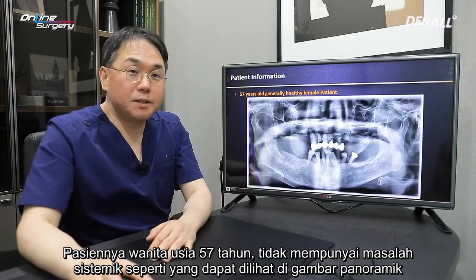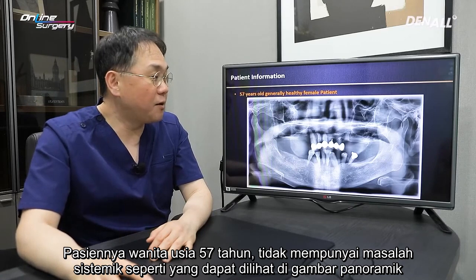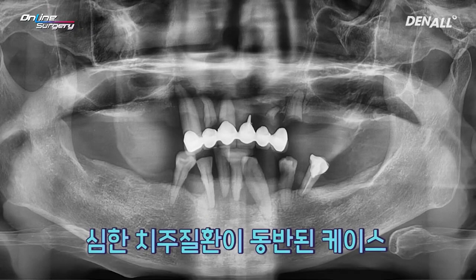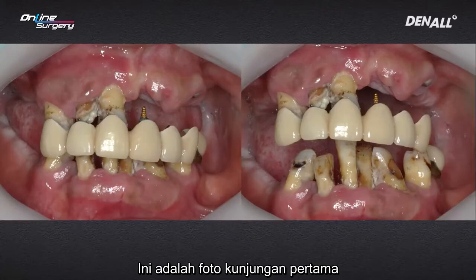This is a 57-year-old female patient. There's no specific systemic problem, as shown in the panoramic image. There's very severe periodontal disease in the residual teeth, and a few of them show root rest. This is at the initial visit.